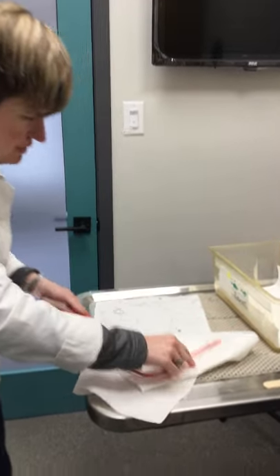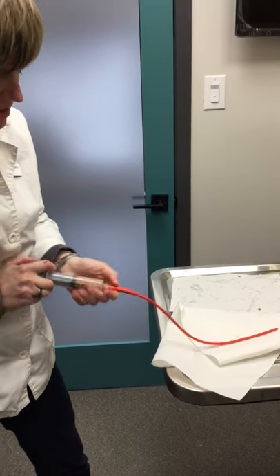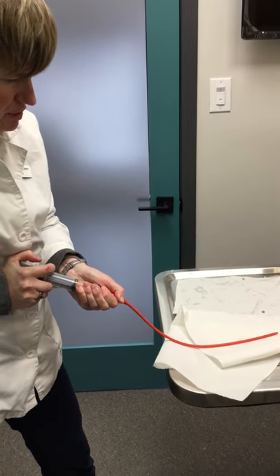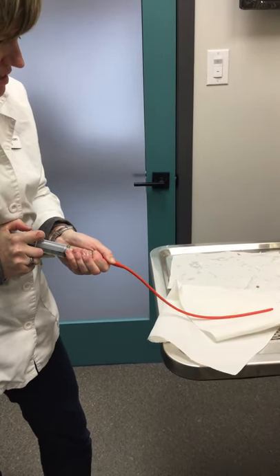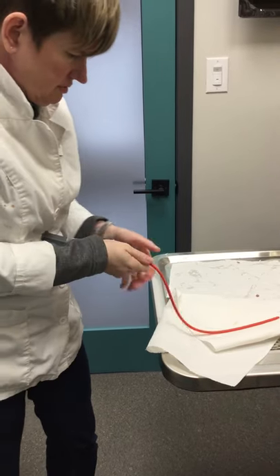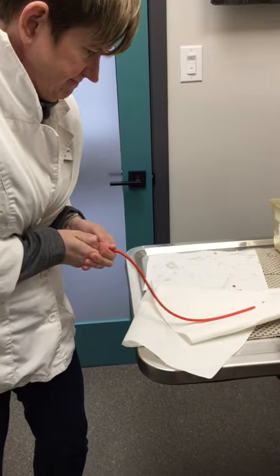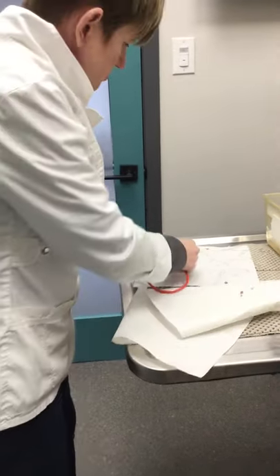When tube feeding your snake, the first thing you want to do is prime the tube. Put your tube on — it's going to take a fair bit of force because this stuff is thick — and push a little bit through the tube so you see it coming out at the other end. You should see a little bit of food coming out into the tube.